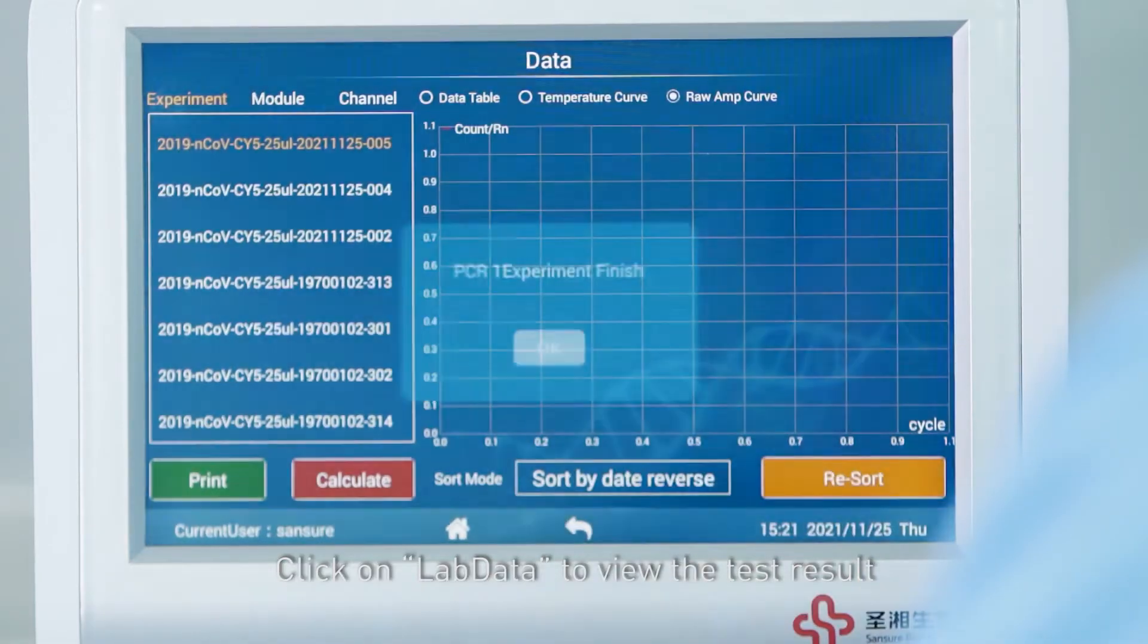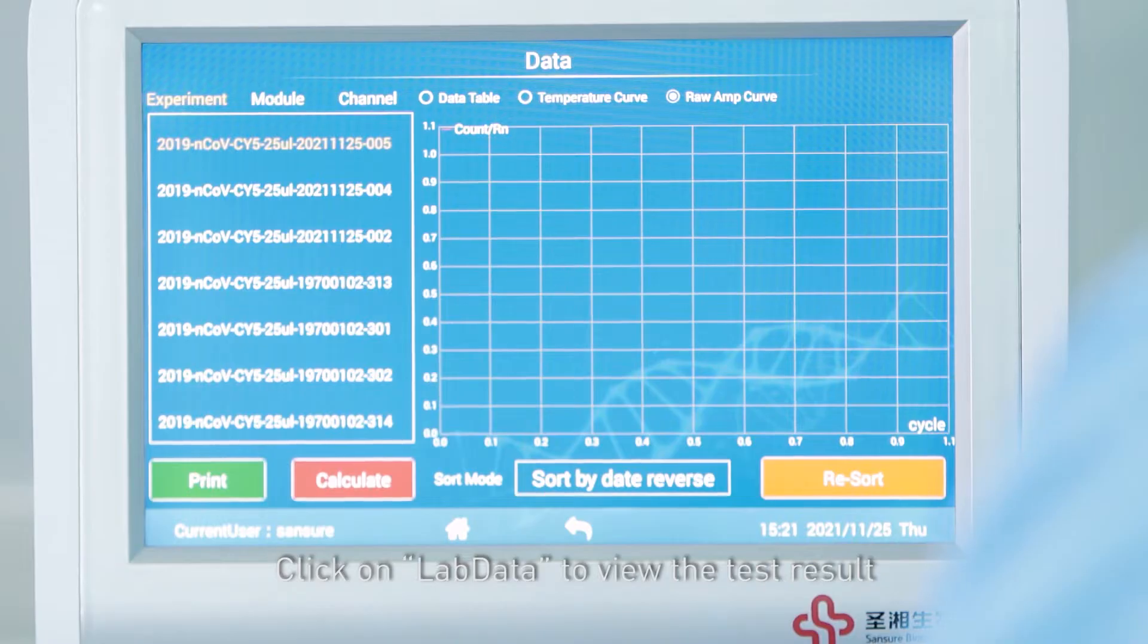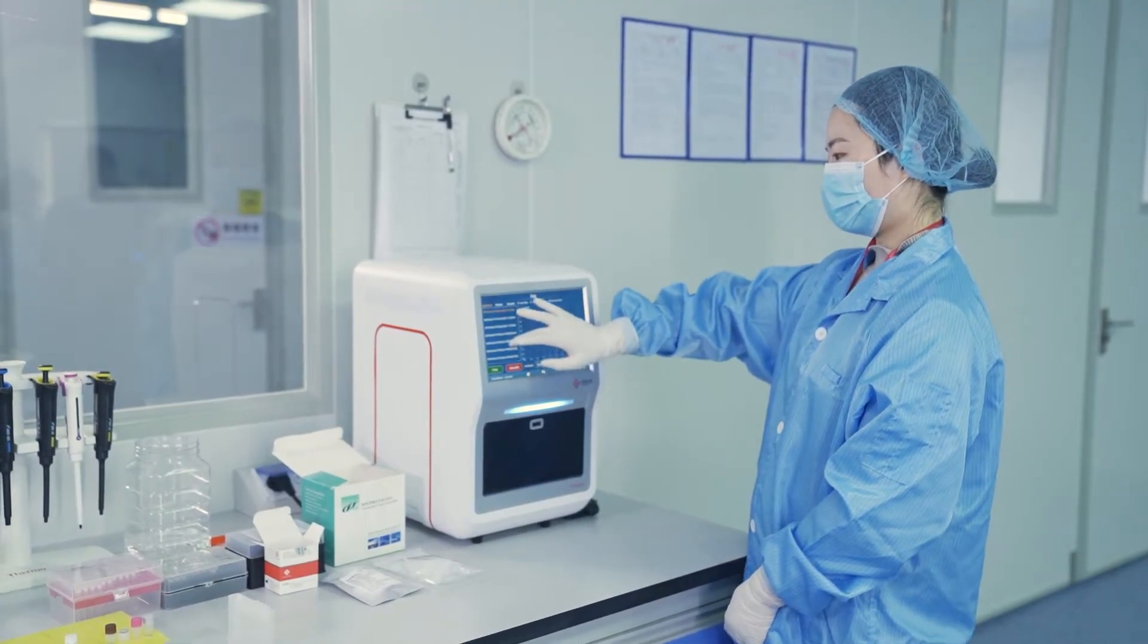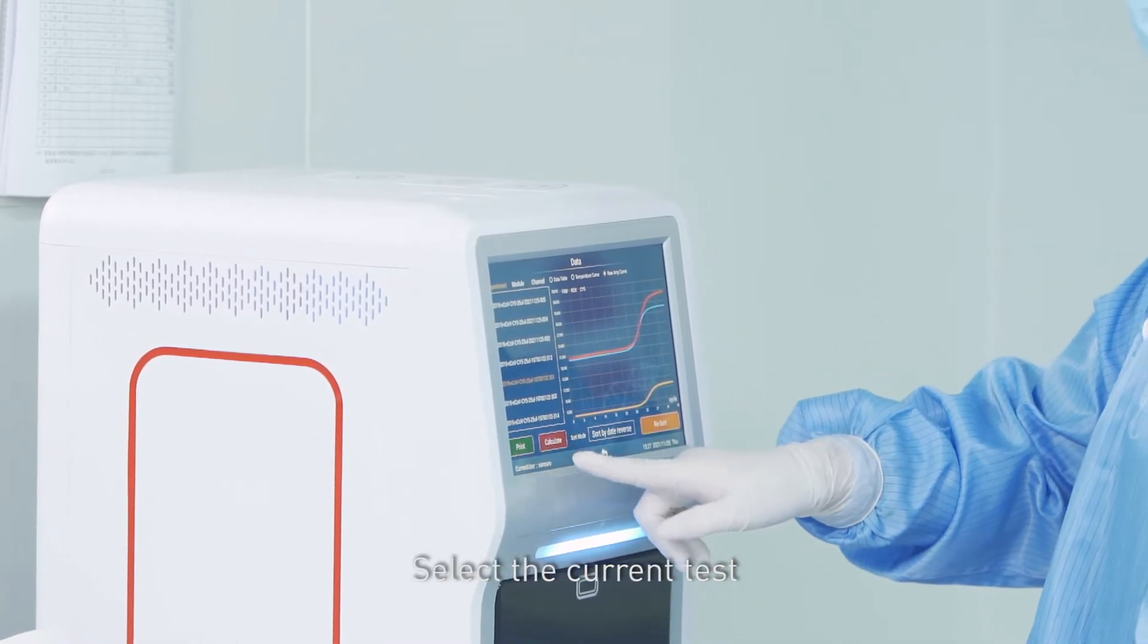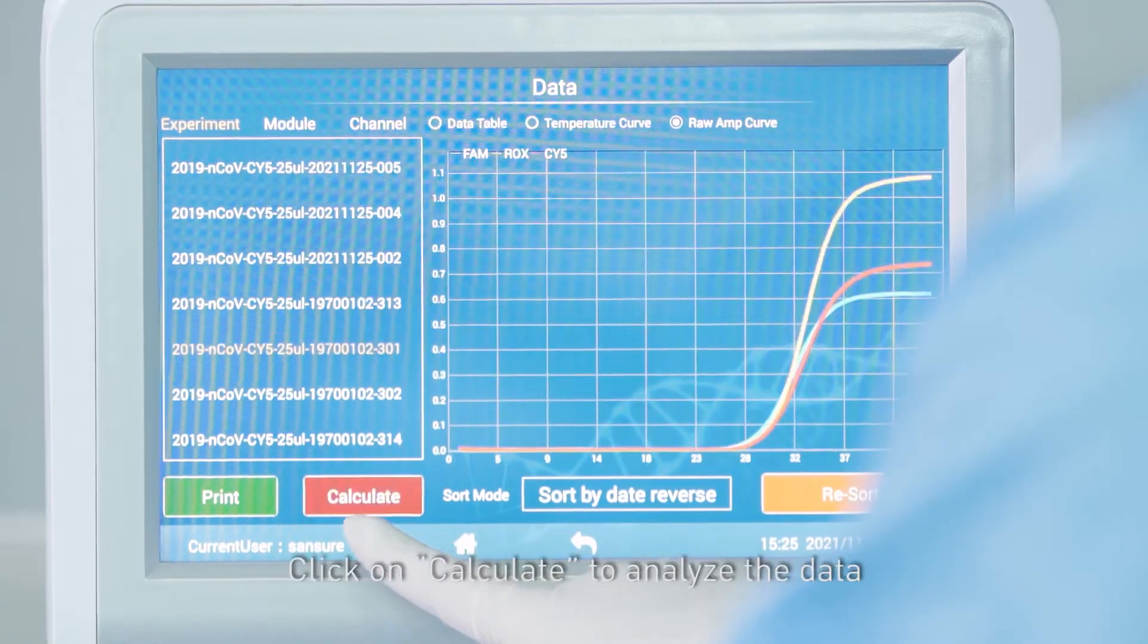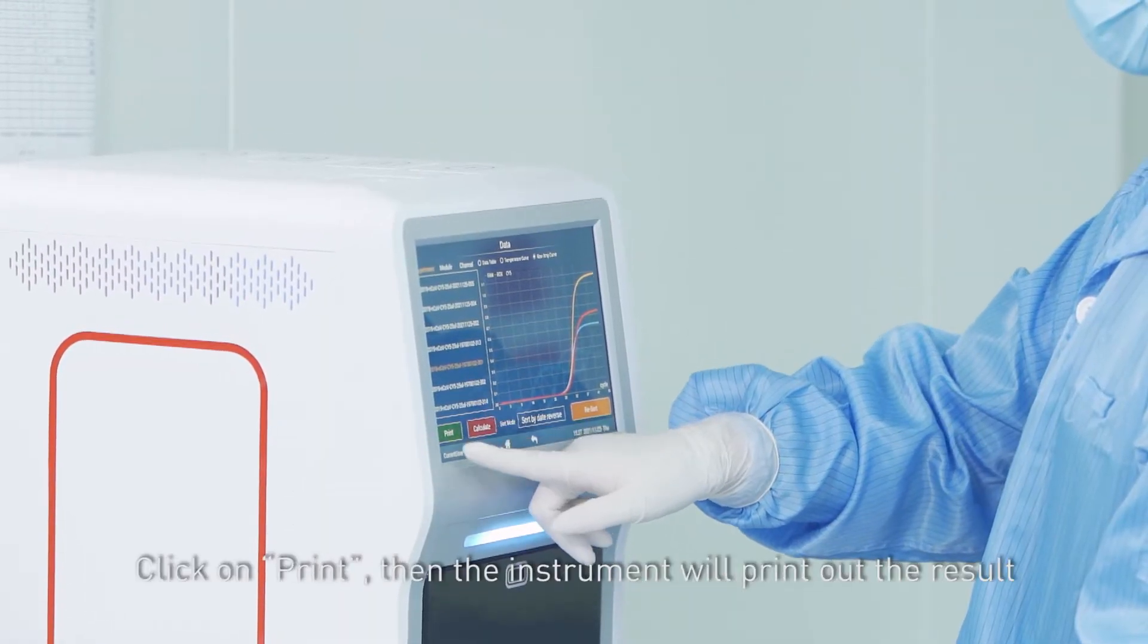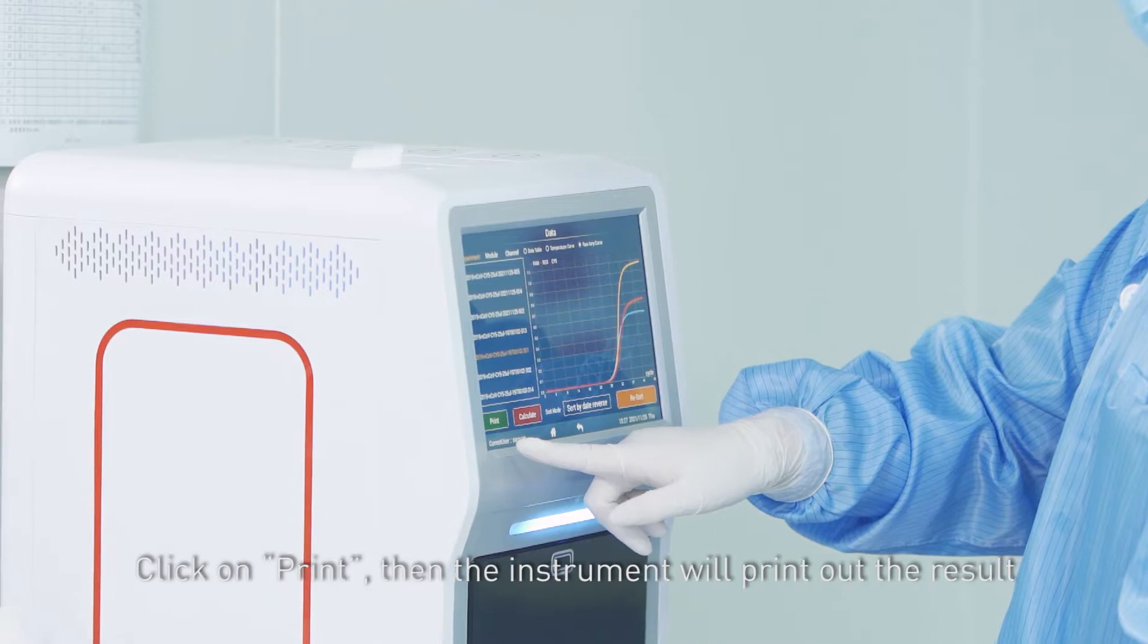Click on lab data to view the test result. Select the current test, click on calculate to analyze the data, then click on print. The instrument will print out the result.